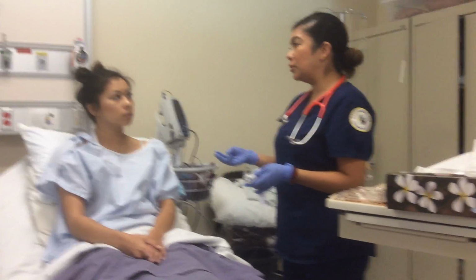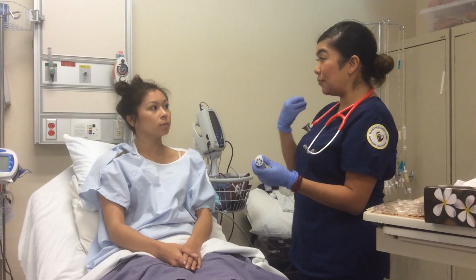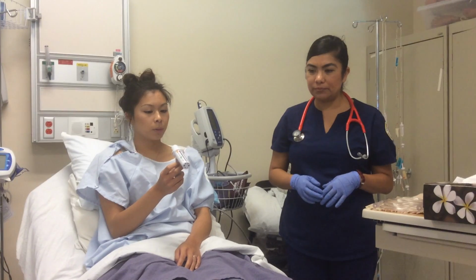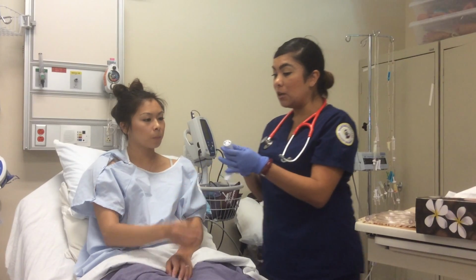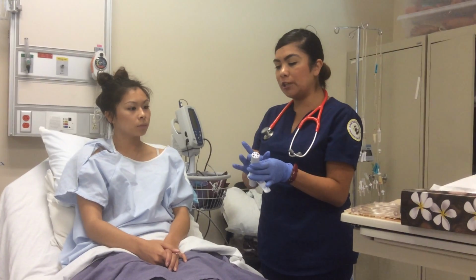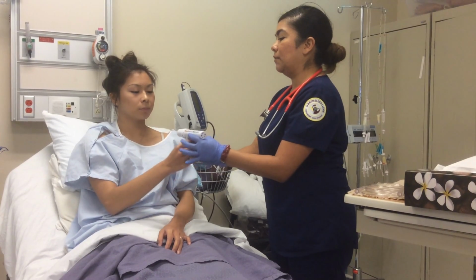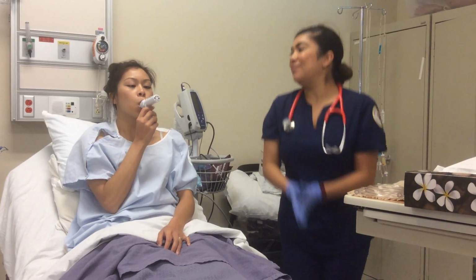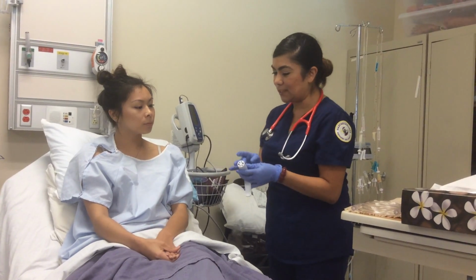Okay, so we're going to get the best out of 3. Okay, so we got 350 on this one. I want you to try to put a little bit more emphasis on the second one, if you can, okay? So breathe out, breathe in, and boom! Very good. Good job. Very good. Okay, are you feeling dizzy? No? Okay, very good. So on this one, we got 400, and we just need one more. Okay? And breathe out. And boom! Very good. Good. Wow, good job. Okay, so we've got 400. So we'll take 400 as the best one for right now.